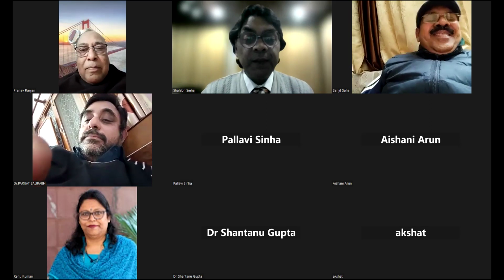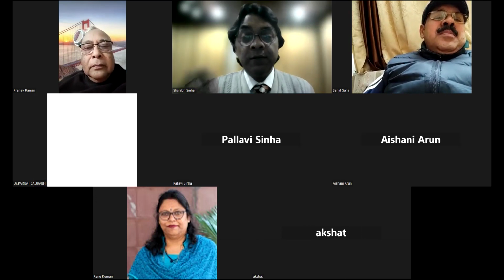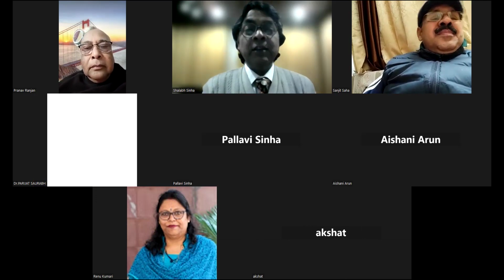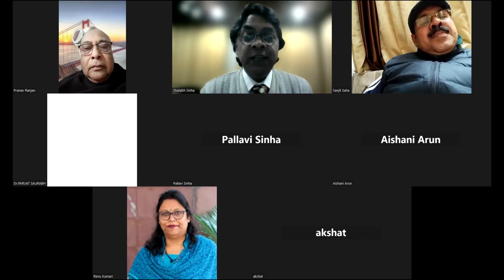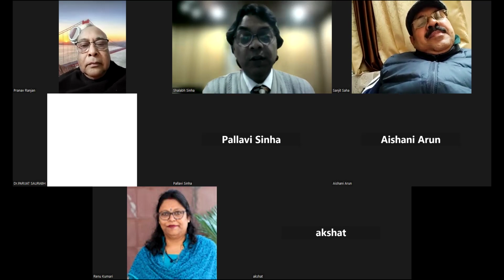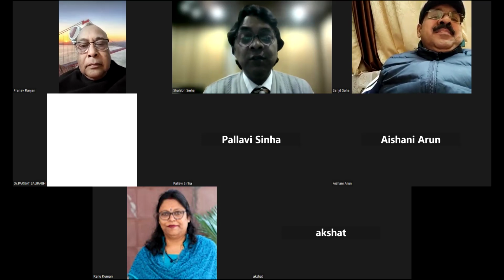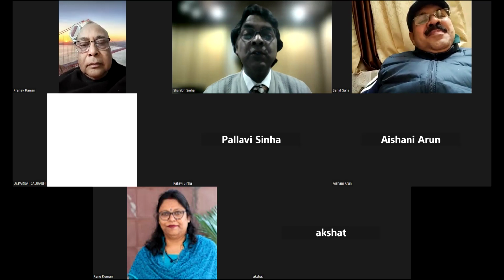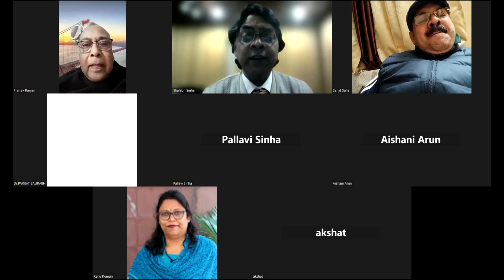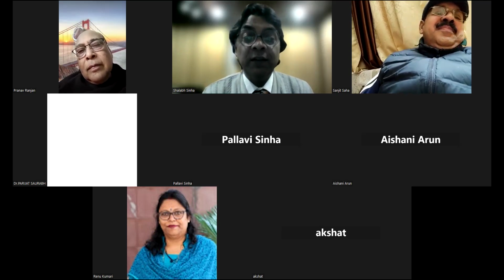So what I wanted to show today was that there can be situations wherein you have a very soft cataract. It converts into a bowl and doesn't come in very easily. What you can use is visco to dissect it, bring it to the center and then bring it out. You don't have to keep trying to catch it at the edge because there are very high chances of creating a posterior capsular rent. And most of these soft cataract patients are young patients, and if you have a PCR, the chances of posterior segment complications are going to be there.